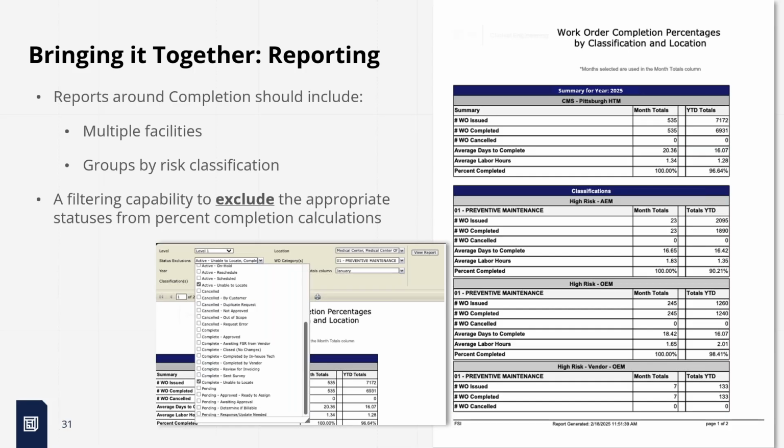On maintaining an accurate inventory without spending resources going out to stores to look for high volume devices, thermometers, things like that. For strategy around things you're not performing inspections on, your run-to-fail type equipment, you're obviously not looking for it, so that would be one thing. But on some, and this is my opinion based on talking to others, are you willing to take the hit on something like that if you're not doing it?